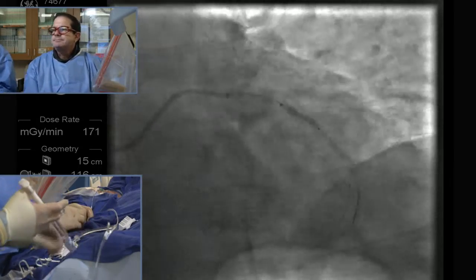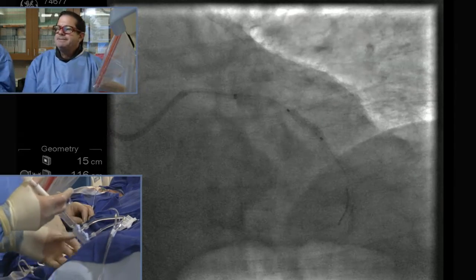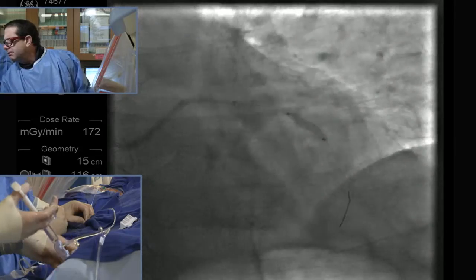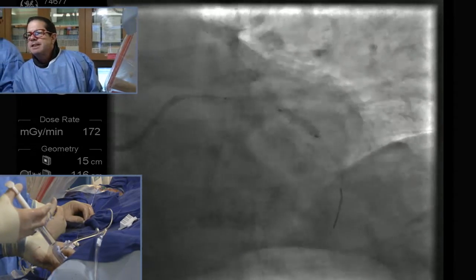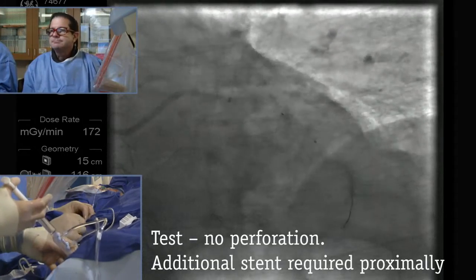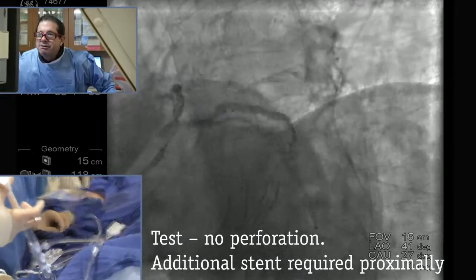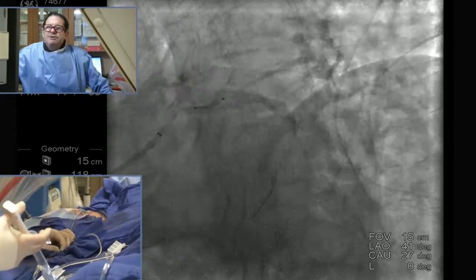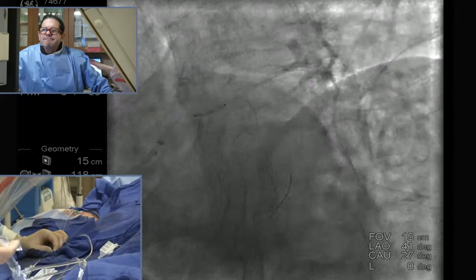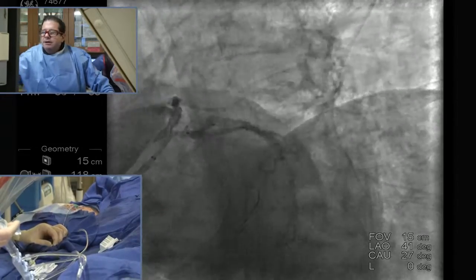Is this not long enough, guys? Are we going to have the same problem we just had? Are we going to IVUS this or no? I feel like it should be longer. I think you should cover the ostium — it needs to be longer. Is this a 12? Yeah. I would go with a 16 or 20. Let's try a 20. As far as going after the right, I wouldn't do the right — that looks like it's going to be just as hard as this case. I would instead FFR the LAD and get the issue resolved whether you need to do the LAD or not.